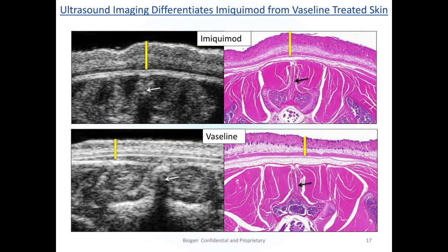We had these conversations with our clinical group. And so there was a big focus. This was a while ago. These programs aren't actually ongoing right now, but there was a big focus on the disease scleroderma. So this is the human autoimmune disease. It's the skin thickening, dermal thickening disease. The word from the clinical side, historically, was that our in-house clinicians had generally heard that ultrasound was not a favored technique because of the usual explanation of operator variability.